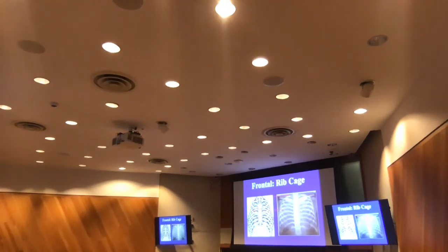Also, the chest X-ray is taken from the back, right? So, if you did not quite master this, it will not be an issue for the lecture, but those who did, teach it to others, okay? So, this is posterior first rib anterior. Second, posterior rib anterior second. Third rib posterior lateral anterior. So, this is the point of interest, okay?